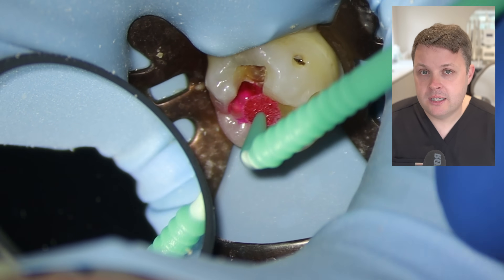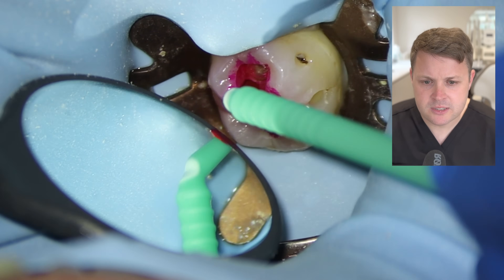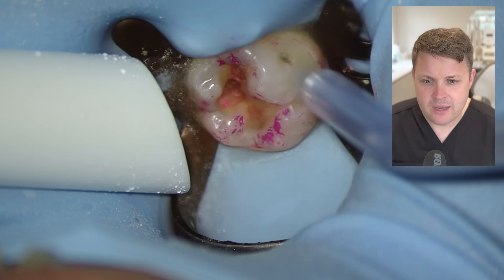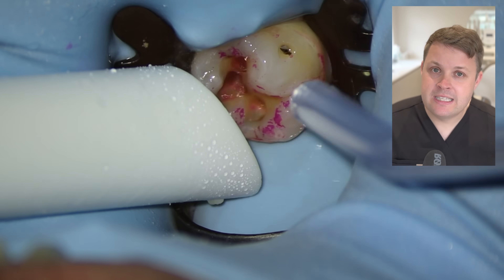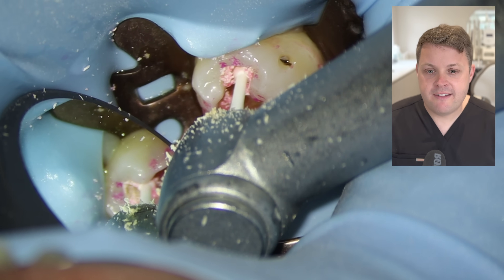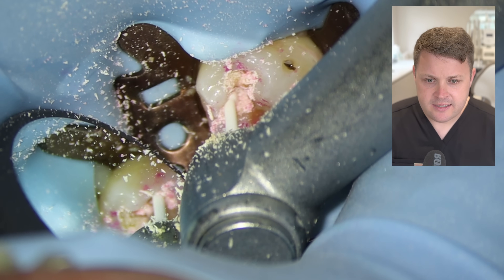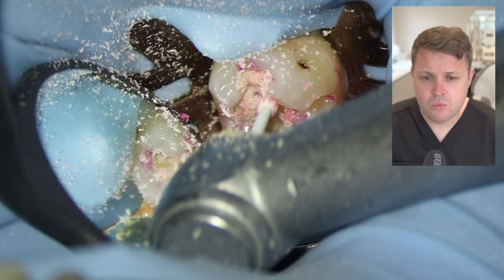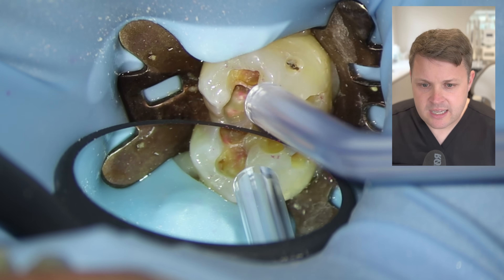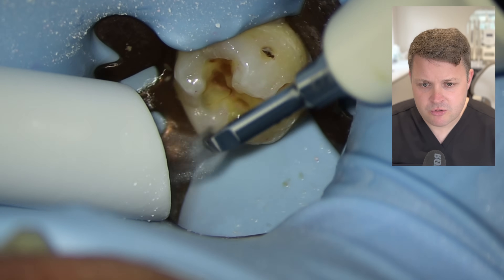Now I'm going to use caries detection dye. I've started using it more frequently, and I'd like people's opinions on it — I think it's pretty good, but what I've noticed is it does get all over the place. When we wash it away, we can see the caries detection dye is stained at the occlusal surface, which needs to be removed. I'm using an ultrasonic tip to clean it up, then using the ceramic burrs to very judiciously remove any remaining decay.